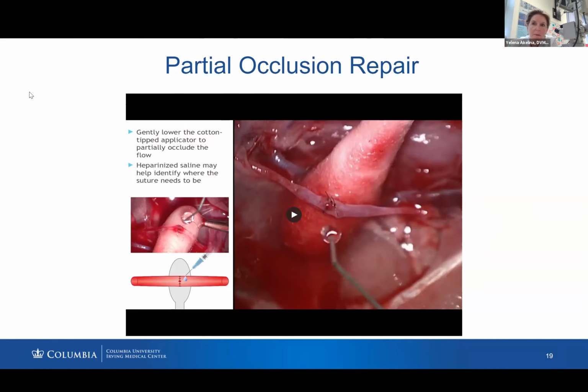Once you clamp it, the blood will stop. By the time you figure out your suture, if you place the stitch, it might take a few minutes. It's a 1 millimeter vessel. You open it up and it's occluded. So this Q-tip is a good prevention of thrombosis after revision. We're gonna move on.